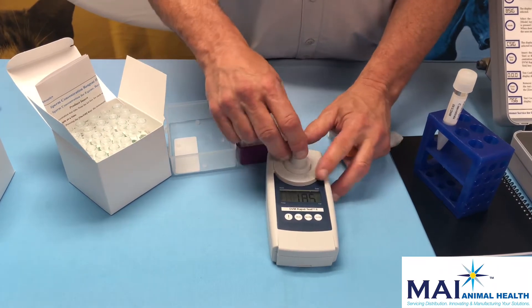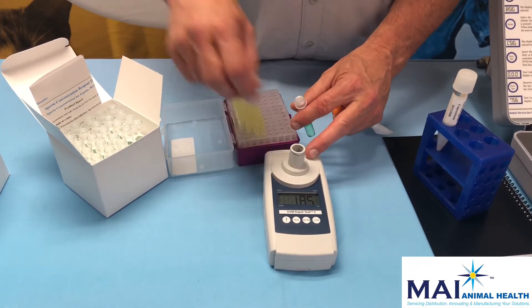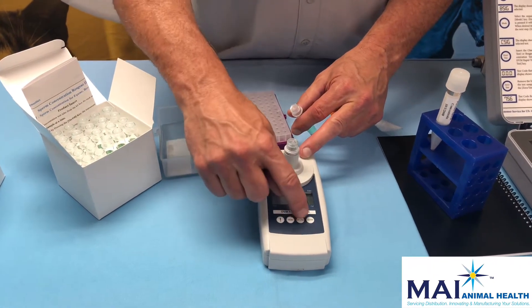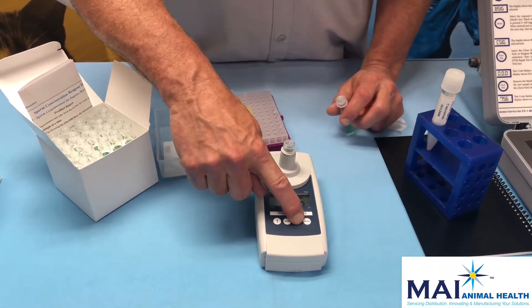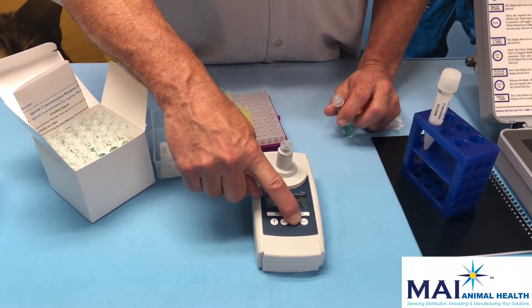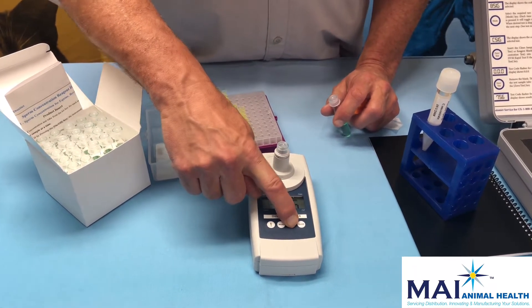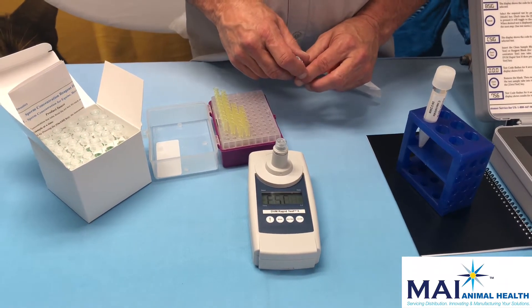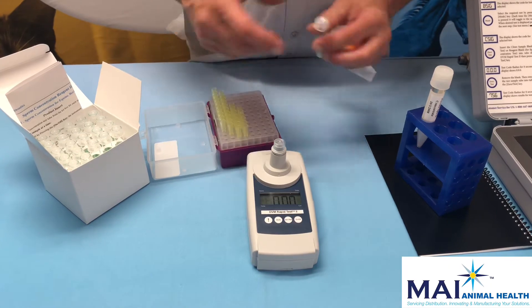You'll get a number — in this case 185, which represents 185 million, or 185 × 10⁶ per mL. To run a second semen sample, get a new tube, place it in, and hold the zero/test button for five seconds. The instrument will go back to zero so you can run the next sample.